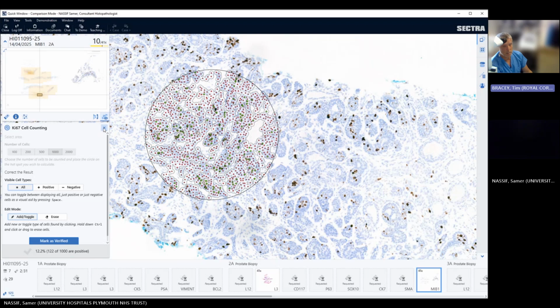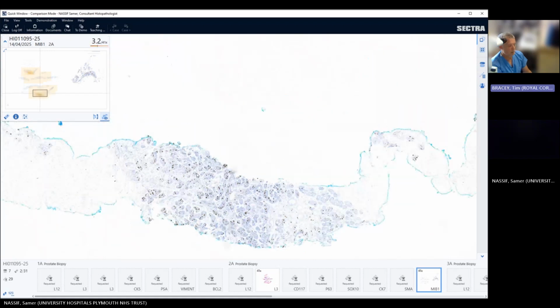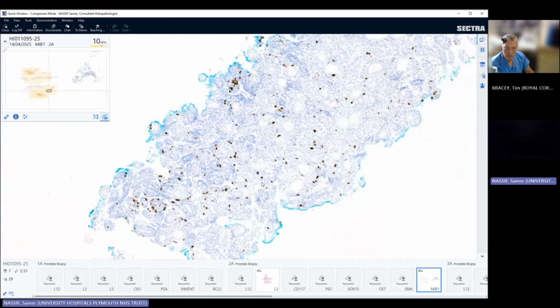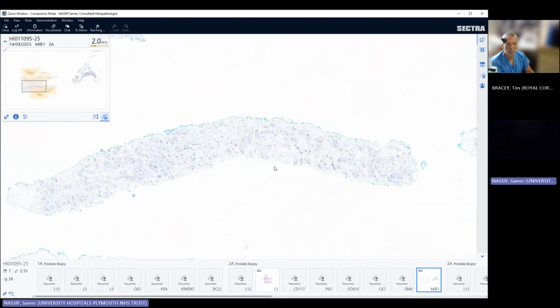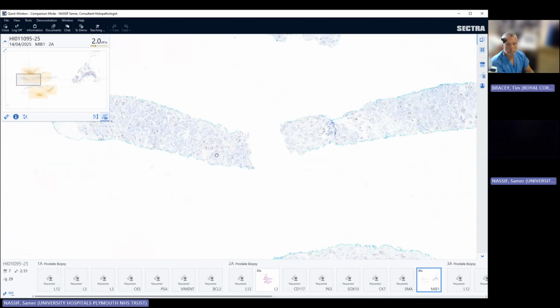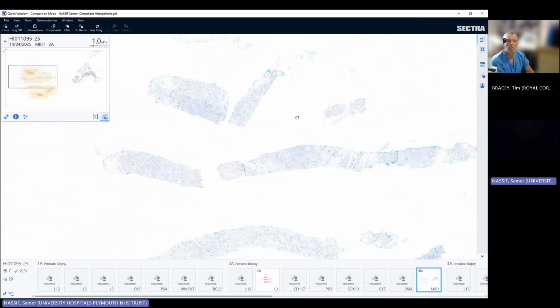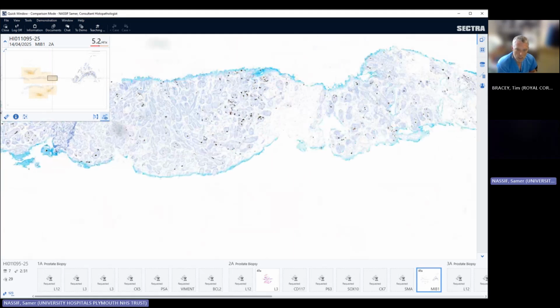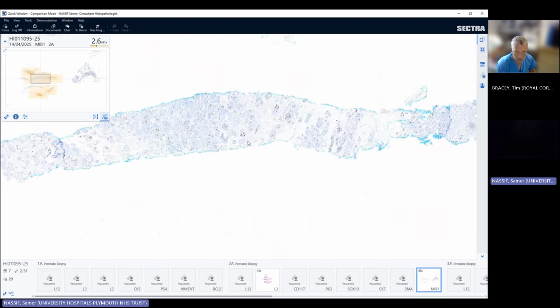I've got a validation study that Sonali Natu's done up in the northeast. I was telling Steve we could basically just copy her validation study. I mean, we'll have to do it internally. It's not a big deal. If you just get like 10 cases and compare them, I should think that should be enough. So you see, it's a very low Ki67. It is. So I'm kind of reluctant to call this adenoid cystic. I just don't know what to make of it.